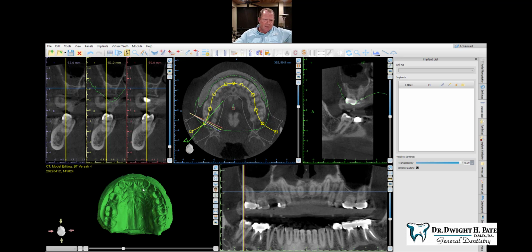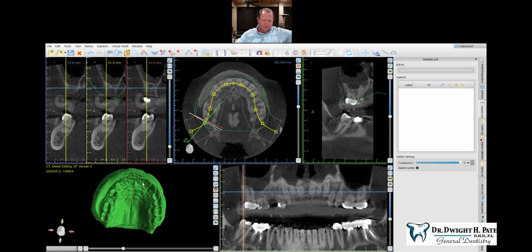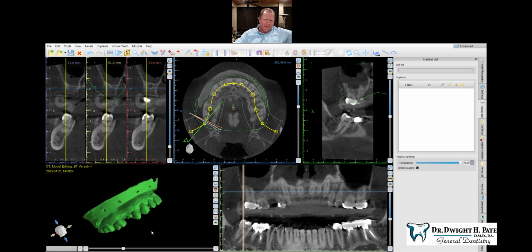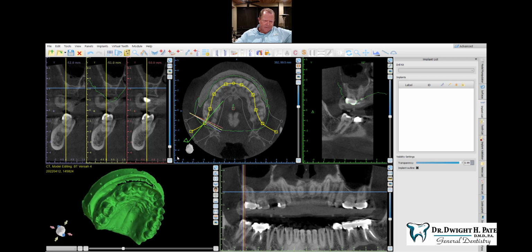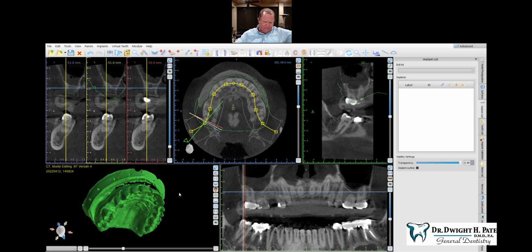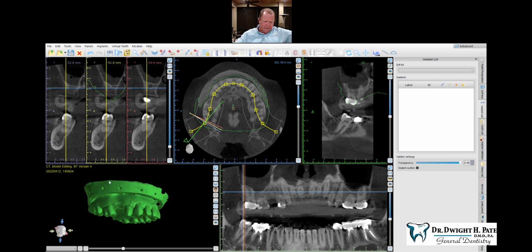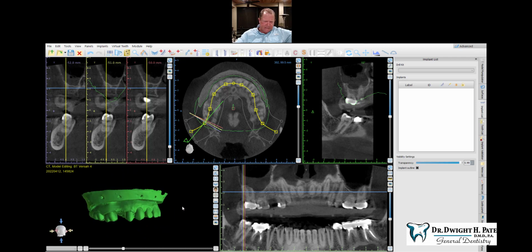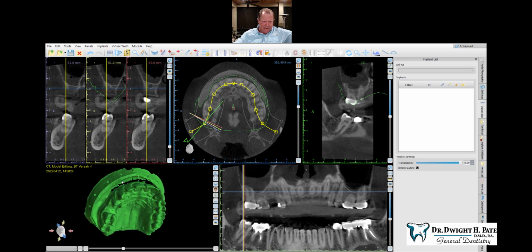Versah is a specialty set of burrs that are designed to expand bone and condense bone rather than cut bone. And so they're very effective for bumps, vertical sinus lifts, and also ridge expansion. There's a lot more you can learn about Versah at versah.com or with the Versah company. They teach courses on how to use their burrs.